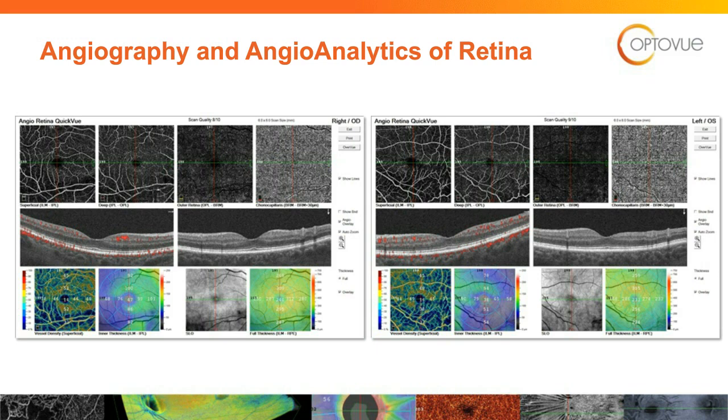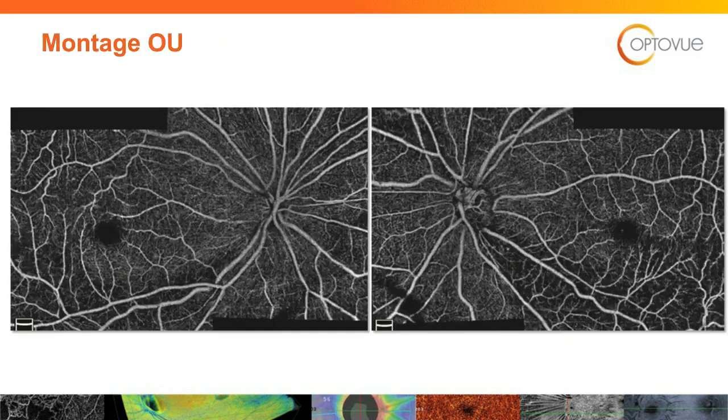If we go over to the left eye, the same two, you can see that tie-dye map of that retinal thickness. You can see how it's more compromised than the right eye. And then you can see how that wedge defect just kind of comes right on over from where that came off of the radial peripapillary capillaries. And this is how we're able to show this to the patient. There's no measurements here, but this is really showing off to them how the capillaries are being damaged.